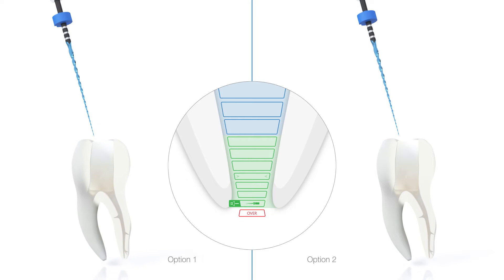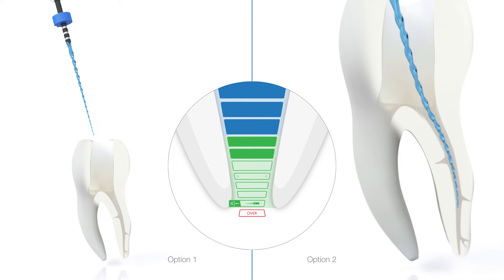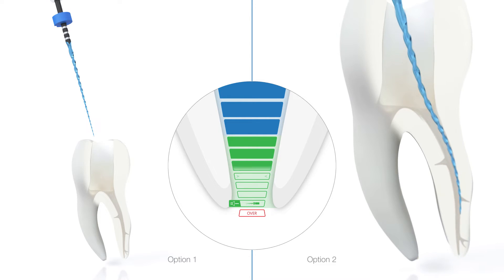For a brushing motion, insert the rotating instrument into the root canal without touching the canal walls. Whilst keeping the instrument in the canal, exert gentle pressure and allow the instrument to touch the canal wall, making small outward stroking or brushing movements over one to three millimeters in a coronal direction. Allow the instrument to move apically for one to three millimeters and then repeat the stroking or brushing movements, gradually advancing towards the apex with an up and down movement.